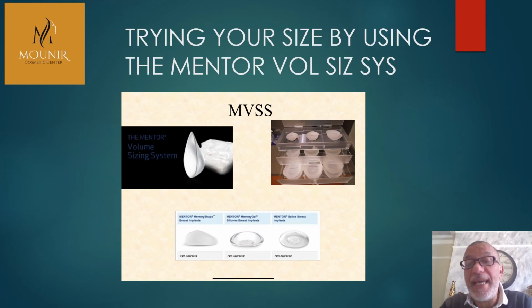I just wanted to say that once you try the implant, I advise my patient to take a photo of the implant inside the bra, because when they go to speak to the mom, the partner, the sister, or the friend, it's better to discuss it with someone whose opinion you trust.